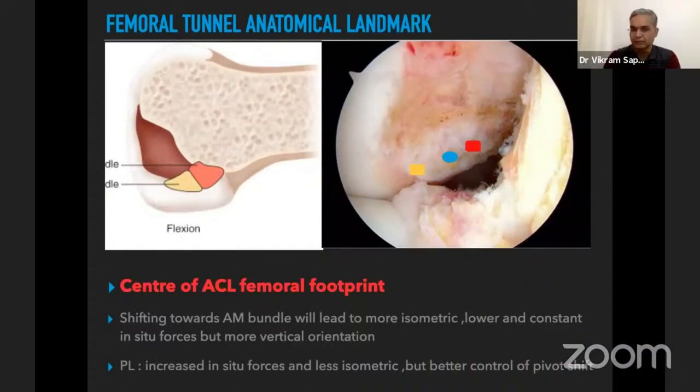The target is the center of the ACL femoral footprint. If we shift more toward the AM bundle, it gives a more isometric position but less pivot shift control. If we shift more toward the posterolateral bundle, it increases in-situ forces and is less isometric but gives better pivot shift control. The best position is the center of the ACL femoral footprint.